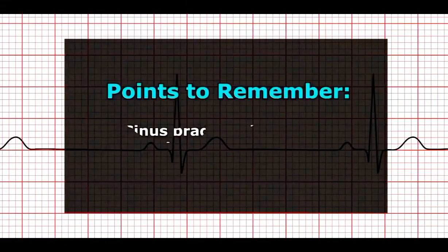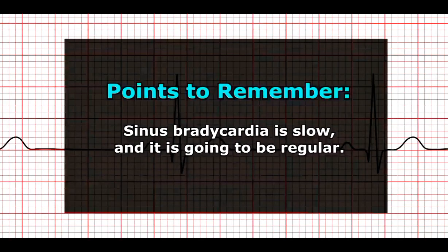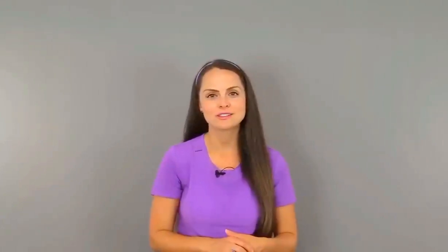A big thing you want to remember about sinus bradycardia is that it is slow and it's going to be regular. Now let's look at the causes of sinus bradycardia. What could cause the heart to beat at a slow rate? Well, there are many causes of this. To help us remember those causes, let's remember the word slow rates.